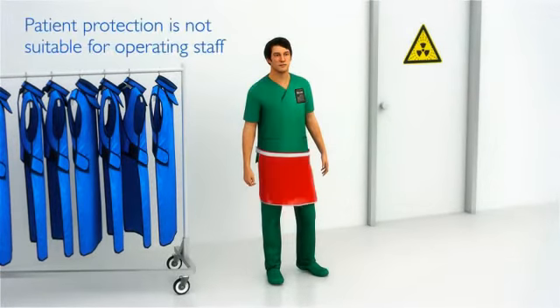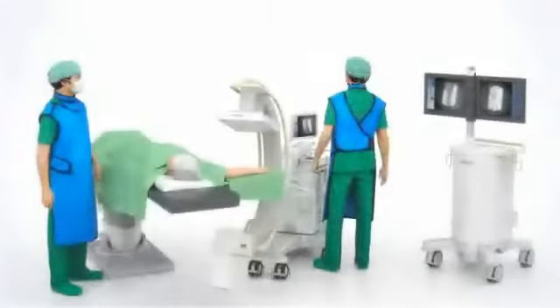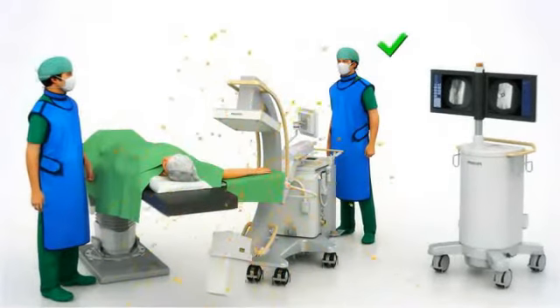Patient protective devices do not shield the operating theater staff sufficiently and therefore are not appropriate. If protective lead aprons with an open back are worn, one must always face the source of radiation if the source is activated.